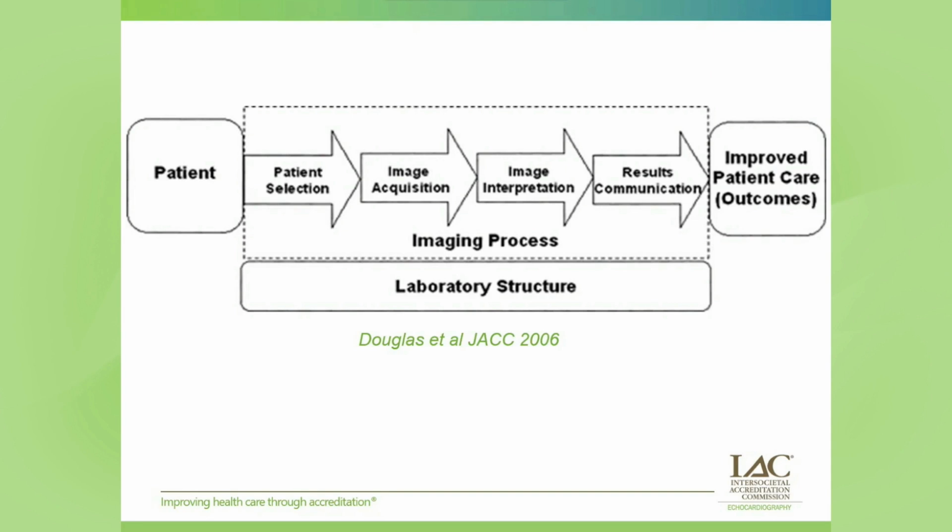Next is image acquisition. So you should be reviewing the equipment. Is it well functioning? Are our technical staff members proficient? Are our imaging protocols complete? And do they meet current standards and guidelines? And also, very important, can a facility safely obtain a diagnostic quality image optimized for each individual patient? Following image acquisition is image interpretation. Are the diagnostic criteria adhered to when documenting pathology? Is the report free of inconsistencies? And of course, most importantly, is it interpreted accurately? Finally, test results must be communicated to referring physicians in a complete, clear, clinically relevant, and timely manner to optimize our patient's treatment.